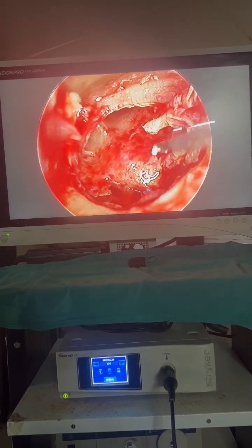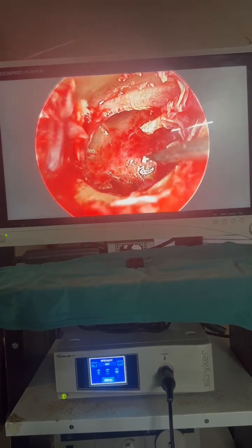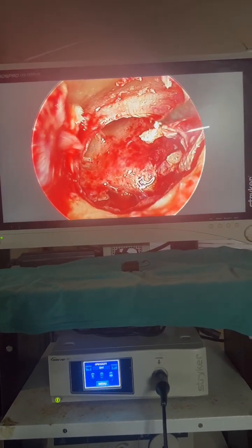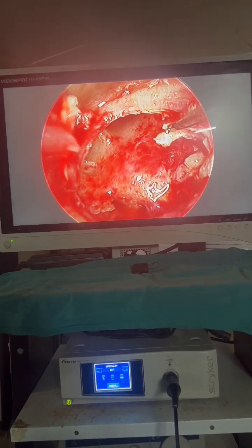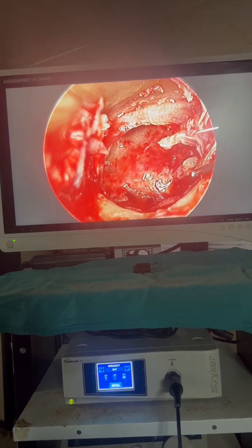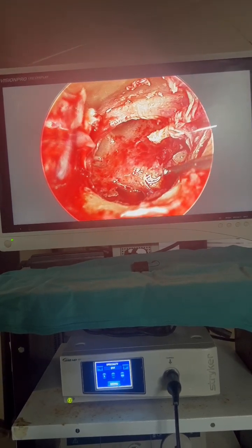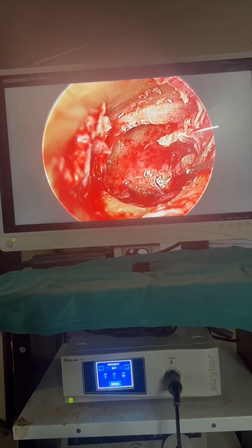Now, on the medial wall, you see the bulge of the basal turn of the cochlea, which is called the promontory. On the promontory, the tympanic plexus is quite evident. On disturbing the chain, you can see the movement of the incus, and here, obscured by the stapedius tendon, is the oval window opening, which is above and behind the promontory.